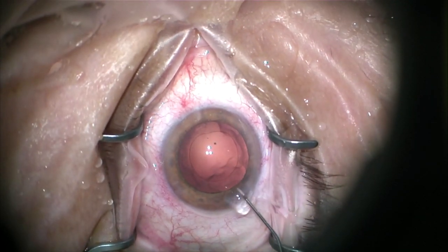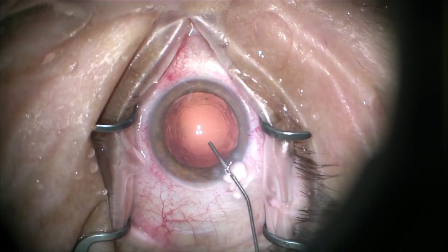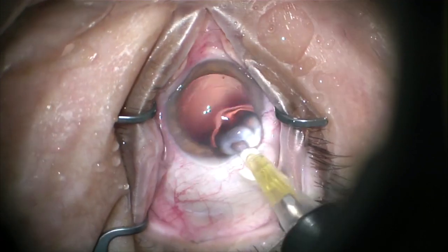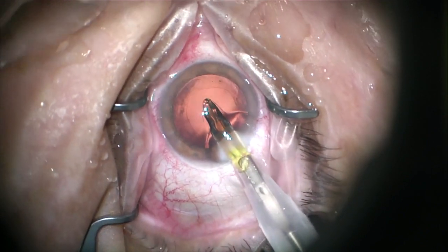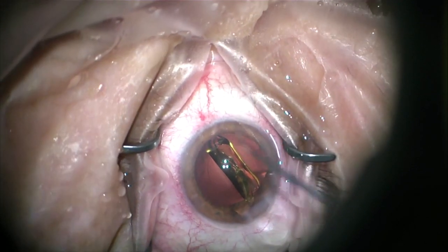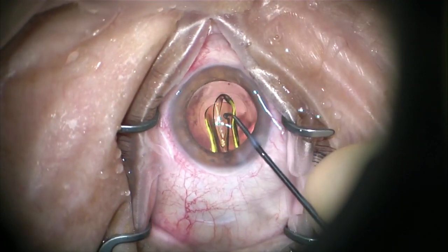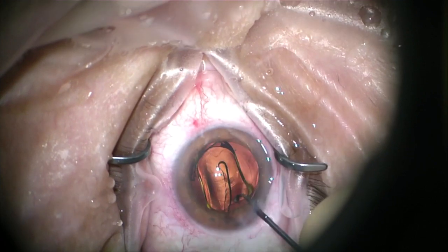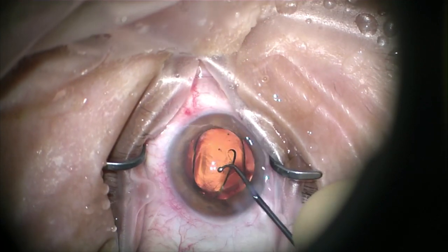When we inject Provisc for lens placement, we want to put some back in the bag — it shouldn't all go in the anterior chamber and push the capsule leaflet back. Remember, you can't hit the posterior capsule if you're actively injecting Provisc, so when you go in just keep injecting and you won't hit anything. We want to go bevel up and then rotate, because you can get an endothelial tear right at the wound edge if you don't go in starting bevel up and then rotate to bevel down. I went back and forth on this a couple of times — I think bevel up is the better choice. I use the Conner; some people use Lester or Sinskey. I use the Conner just because I want the fewest number of instruments in my set that I can possibly have — simpler is better for me.